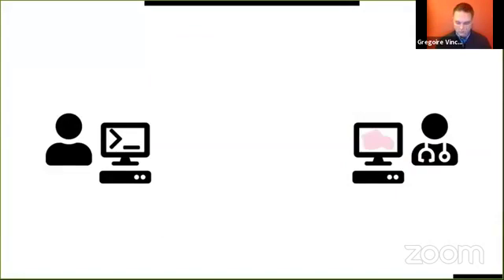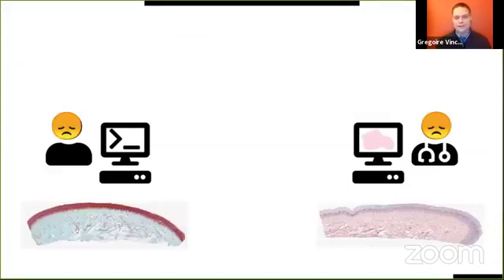And when it comes to the development of AI, you must also pay attention to the staining, because regarding the same pathology with the same type of sample, if the slides have not been stained in the correct manner, the AI will not be trained on correct data and will not be able to be used on the same kind of tissue for the same pathology in another hospital, where they chose another staining to make the diagnosis.